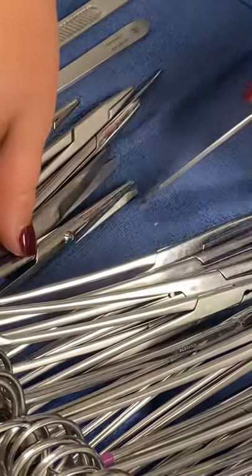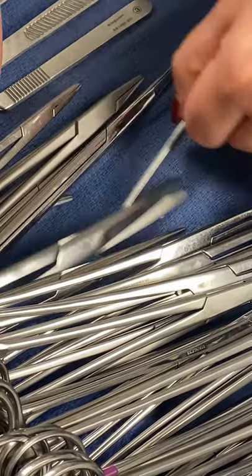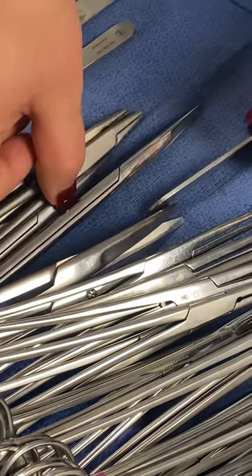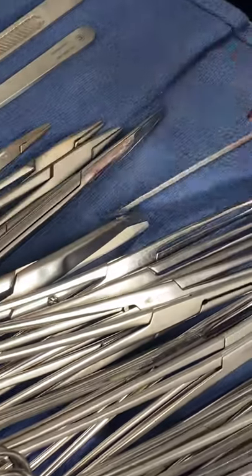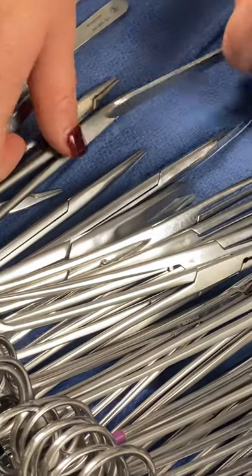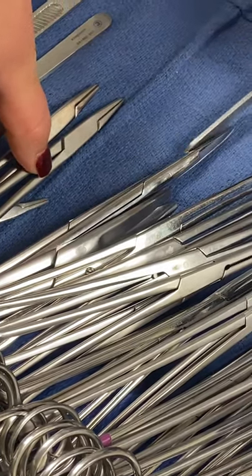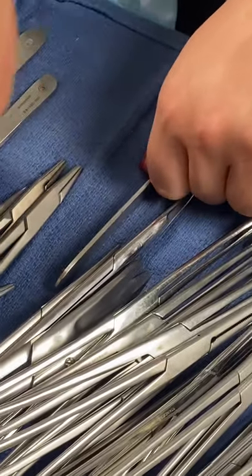And then straight mayo, one. Straight mayo, one. Curved mayo, one. Curved mayo, one. And then long mets, one. Long mets, one. Short mets, one. Just make sure you're saying curved — long curved mets, one. Short curved mets, one. Short mets, one.